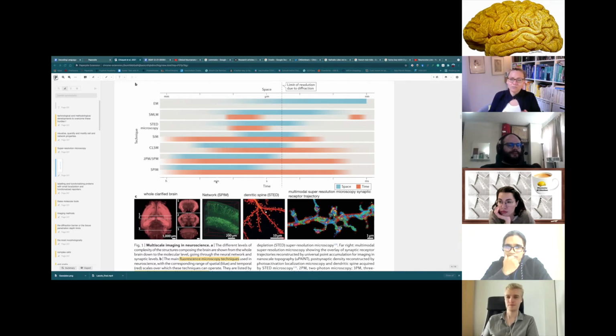Another reason is timing. Usually, in most institutes, we have the luxury of scanner time available to us, but in the clinic, the scanner is used all the time. You don't get easy access to it. So you don't have an hour to scan your participant, you have five to ten minutes. Obviously the acquisitions you can get in that time do not compare to research acquisitions.